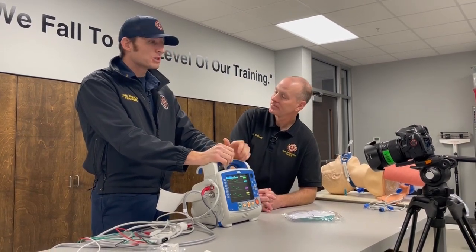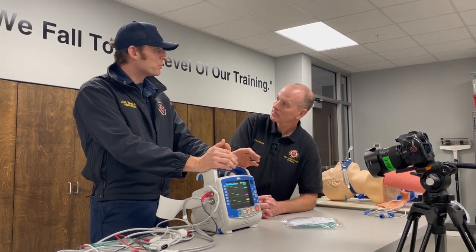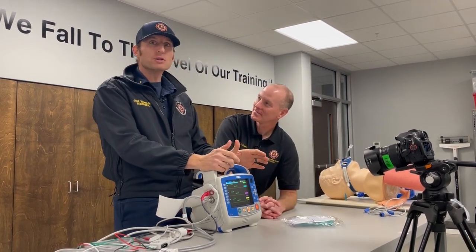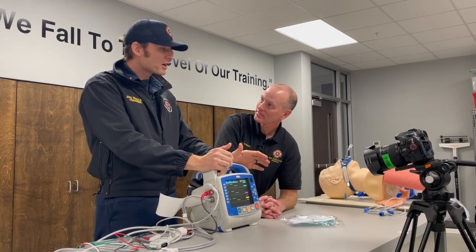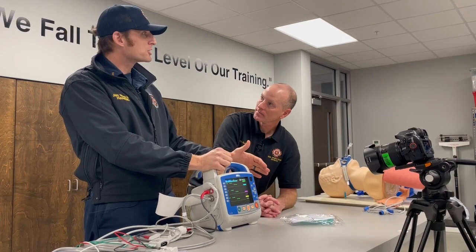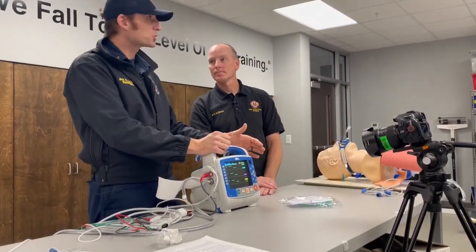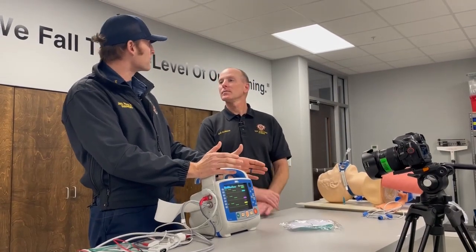No. And I'll tell you too, like I was taught going through paramedic school, going through EMT school, a one-word definition for shock is what? Hypoperfusion, right? Yes, sir. So when you start talking about that, that measures perfusion status. Yes, it does. Think of any patient who has a perfusion issue: shock, allergic reactions, trauma patients, respiratory patients, drug overdoses, any of them. It's an important number, right?